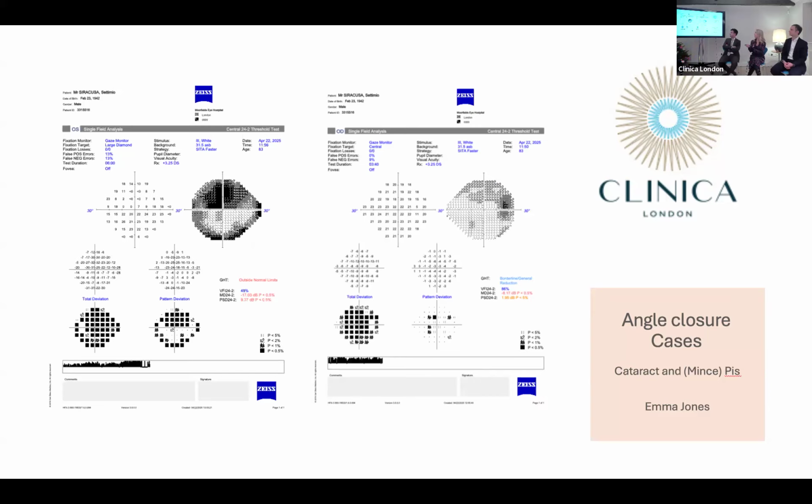So you can see the left eye has a lot of visual field loss, and that's actually from his geographical atrophy. If you're making a decision about doing cataract surgery in this patient, can you see something there that would indicate whether you're going to get any improvement for this patient, other than expecting some improvement because of their age? Is there something on the fields demonstrating that they will probably have a good benefit, even though it's their only eye? The second graph, not the very bottom, the one next to it, that is reduced, and that reduction is most likely because of cataract. Yeah, exactly. That would indicate that the cataract is reducing the visual field, so they will probably benefit somewhat.